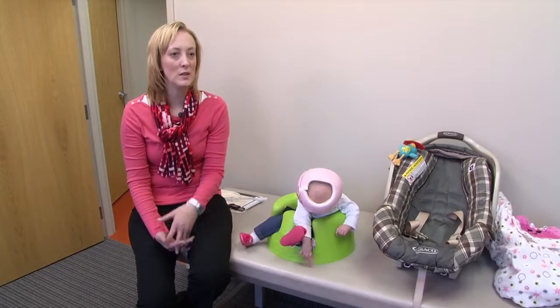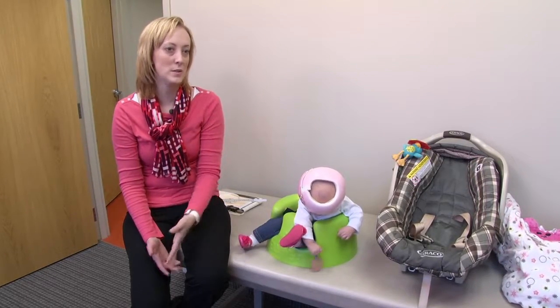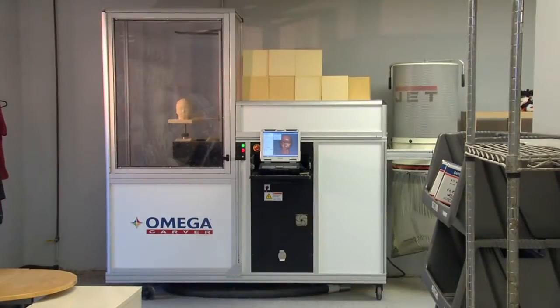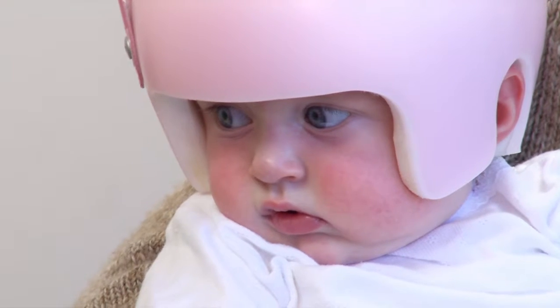A lot of babies will look down in the beginning of wearing a helmet, and it's not due to the weight of it. The helmet was made from a scan that we did of her a few weeks ago. The helmet is comfortable for her to wear because it is not pressing or squeezing her head.